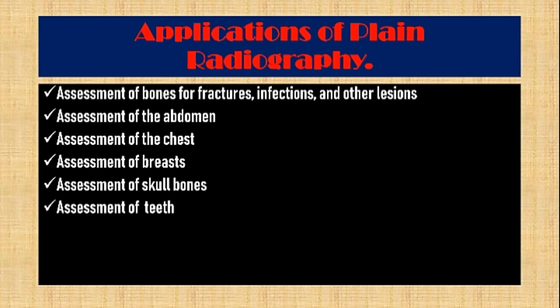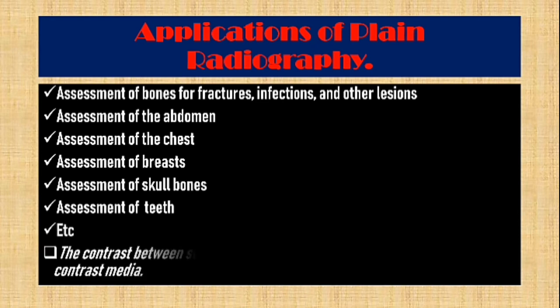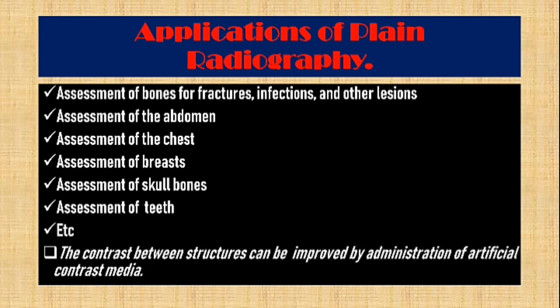It is also used in the assessment of teeth in dentistry, and also for identification of individuals using their dentation. The contrast between structures can be improved by administration of an artificial contrast medium. These contrast media vary. We shall discuss this contrast media in a separate video.